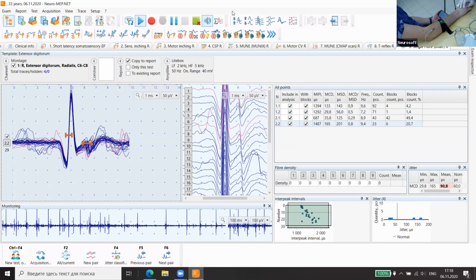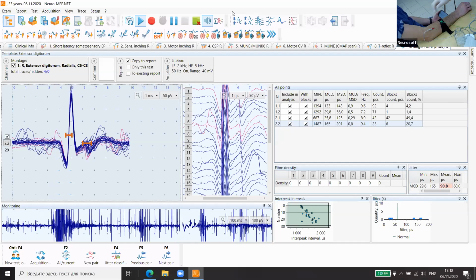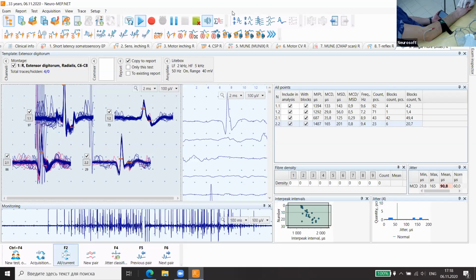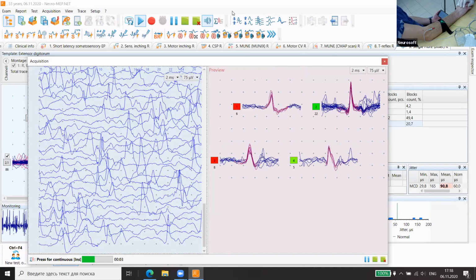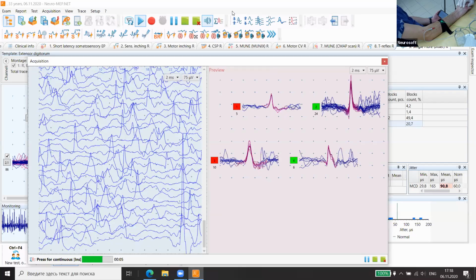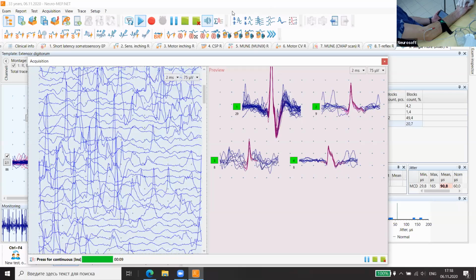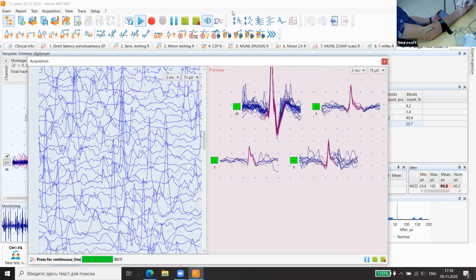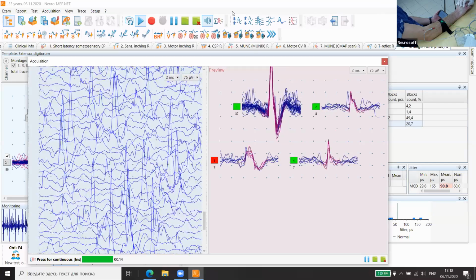Yes, it's not good. Further. And so we need to get up to 20 pairs in this manner. Relax.